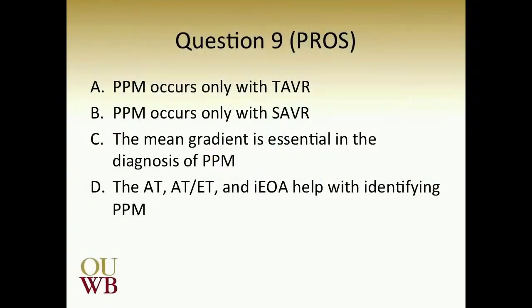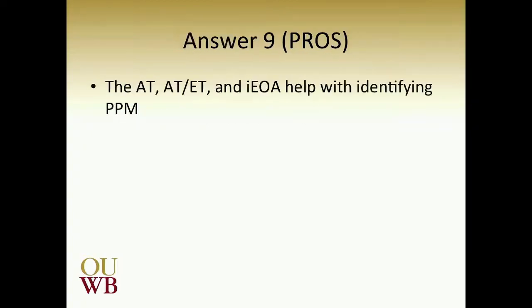But as we mentioned, with prosthetic valves, we do not just count on the mean gradient, but we look at the acceleration time divided by ejection time and the indexed effective orifice area to help us identify the patient prosthesis mismatch.